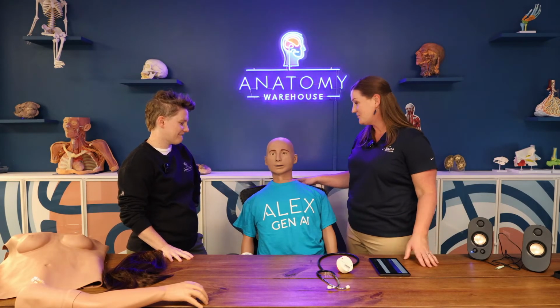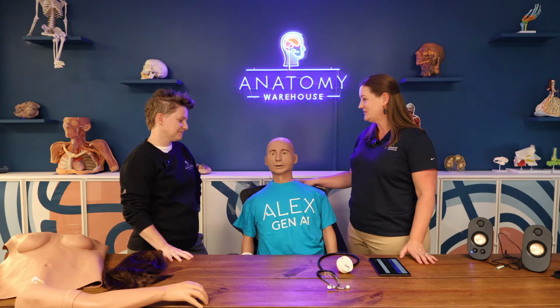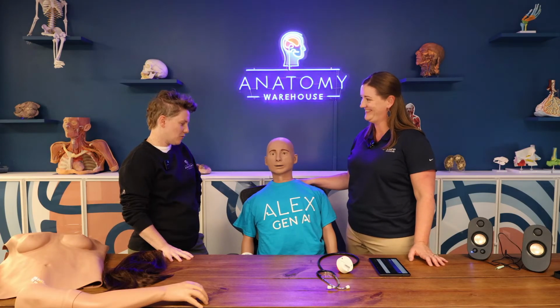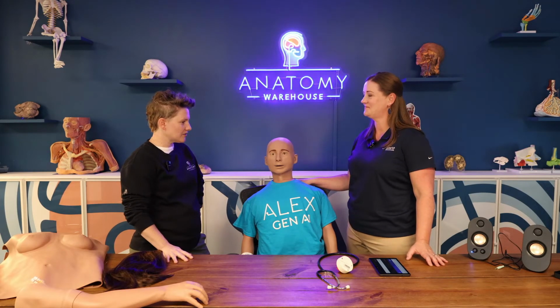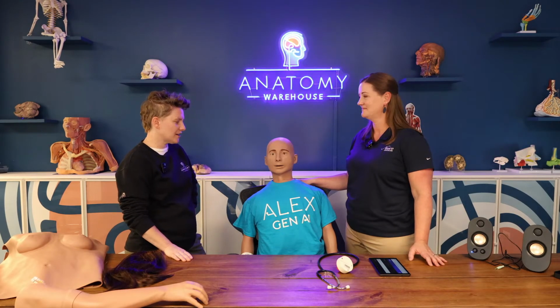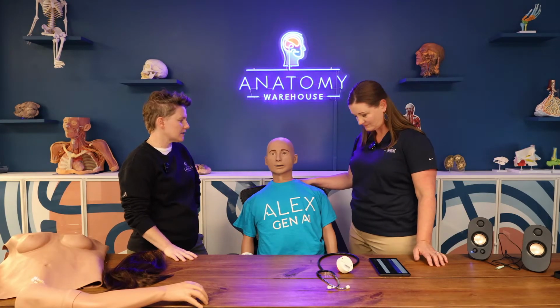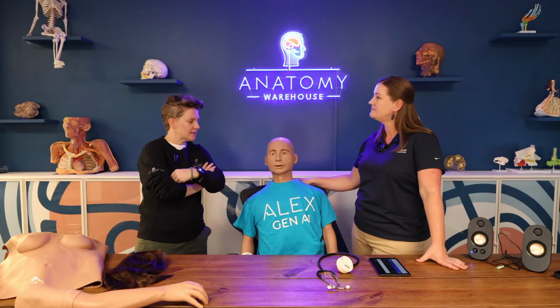We're super excited about featuring Alex Gen AI with Anatomy Warehouse, so we'll just keep him talking. Well, one of the big things we love here at Anatomy Warehouse is just being real and authentic. We're not going to be super stuffy about this. We're just going to have fun today. But yeah, let's kick it off. Tell me a bit more about Alex and all of their capabilities.